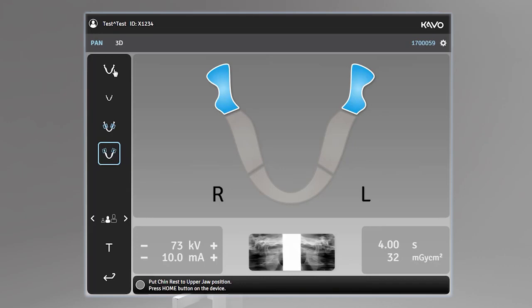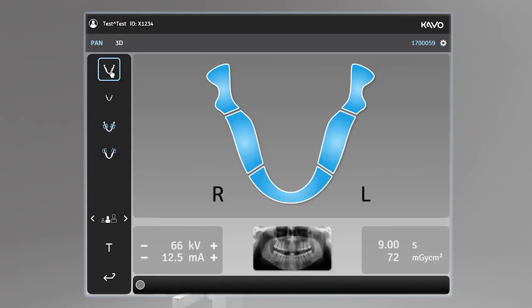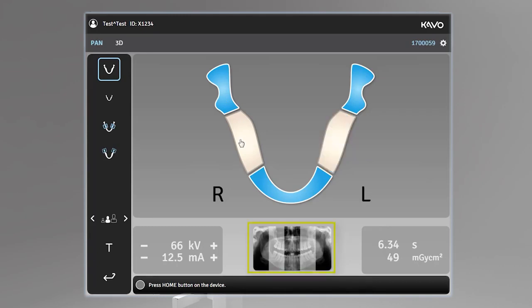The dental chart displays the segments of the dentition to be acquired by the selected imaging program. You can also manually select which segments of the dentition are imaged. A sample image produced by the selected imaging program is displayed at the bottom of the window.